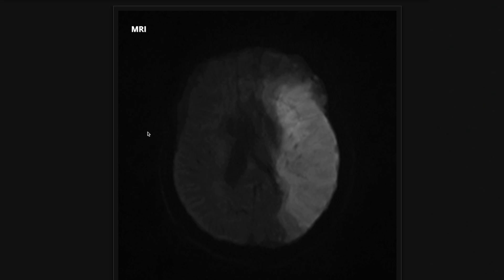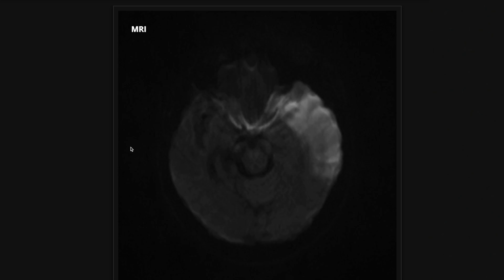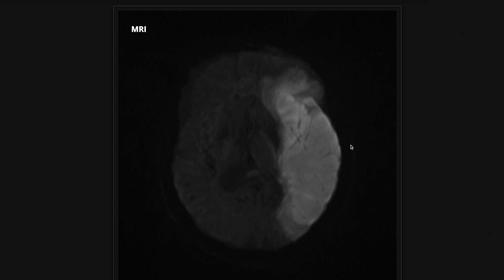Now I'm on a case where there actually is a stroke. This is a diffusion sequence, and as you can see there is hyperintensity throughout the left cerebral hemisphere. This is a left middle cerebral artery territory infarct. This is what a stroke looks like on DWI — you're looking for something bright, in a vascular distribution. This is the middle cerebral artery distribution.